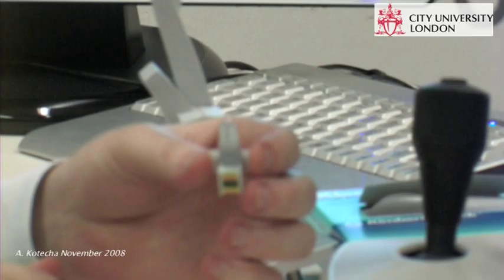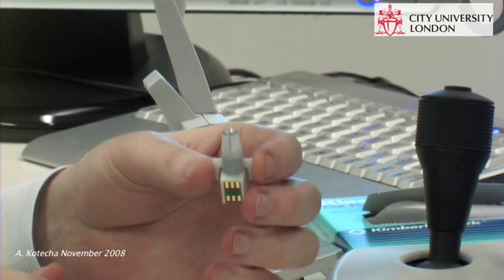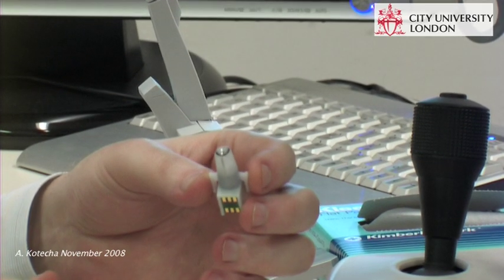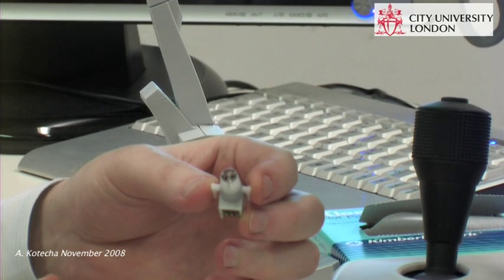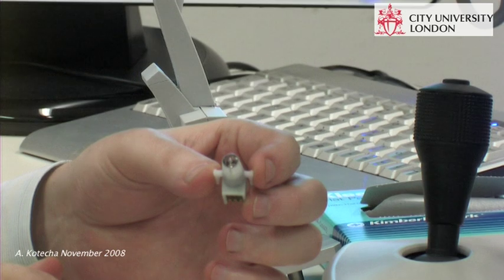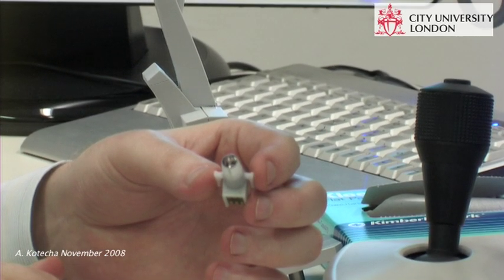The dynamic contour tonometer, or DCT, is a slit lamp mounted contact technique for measuring intraocular pressure. Unlike the Goldmann tonometer, the DCT has a curved surface. The cornea is not applanated, and therefore the effects of corneal resistance to deformation are reduced. This minimises the corneal effect on the IOP measurement.